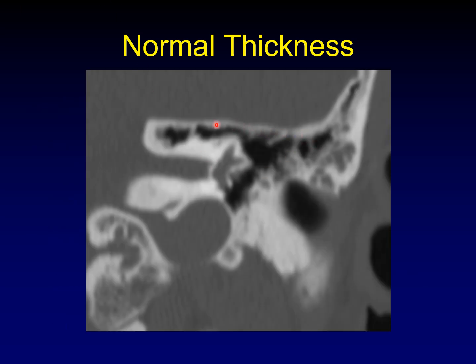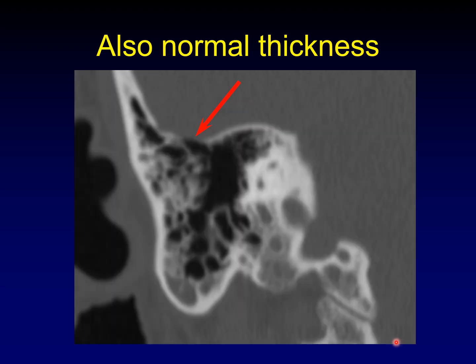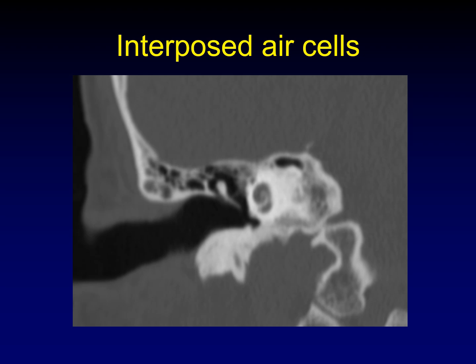This is what I would consider the normal thickness of the tegman — maybe one to two millimeters, fairly uniform. This is some thinning that you can barely see on CT; this is still acceptable — there's no fluid leak, no depression of the dura. Here's a situation where air cells are interposed between the tympanic cavity and the tegman, which adds extra protection; this patient is less likely to run into trouble with their tegman.